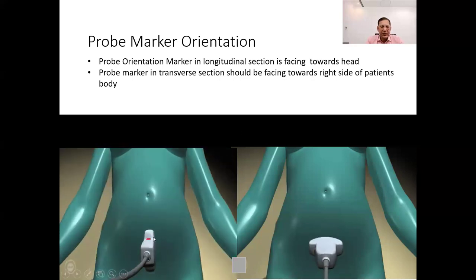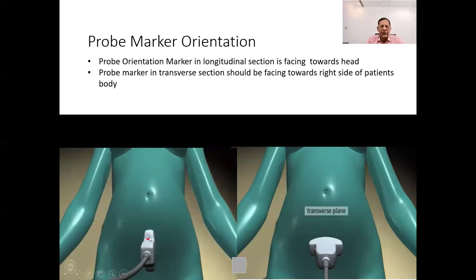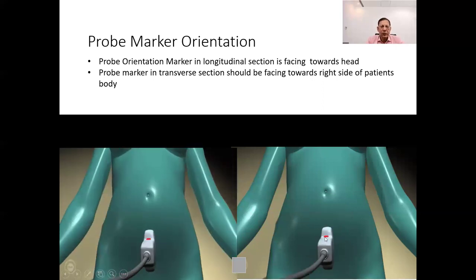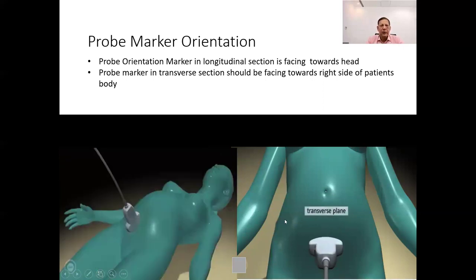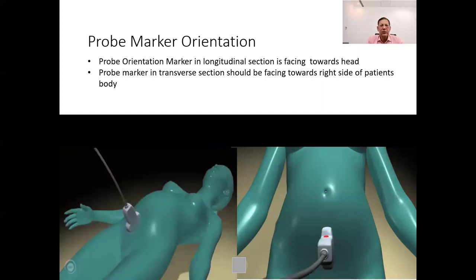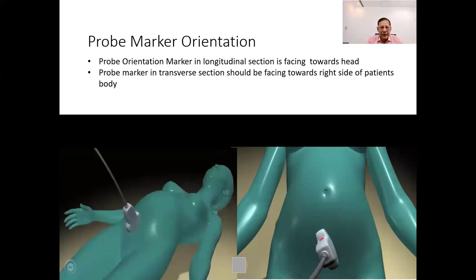While scanning in a longitudinal section — meaning the ultrasound probe is positioned parallel to the long axis of the body along the length of the structure — the probe orientation marker should be pointed towards the patient's head. While scanning in a transverse section, the probe orientation marker should be pointed towards the right side of the patient's body. Operators should make sure the ultrasound probe is positioned correctly, as this helps interpret the orientation of anatomical landmarks and internal structures. The probe marker ensures consistency and accuracy in image acquisition, leading to better diagnosis and treatment decisions.